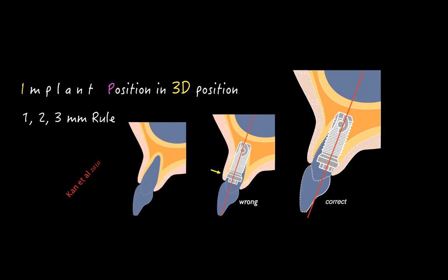Generally speaking, this was very much being done, and unfortunately, I do see this still being done. A lot of patients getting this kind of implant placement, where the implant is exactly where the incisal edge of the tooth is. Now, that's not a problem. I have no problem with patients getting cemented cases, although there is a way to create safer cementable cases.